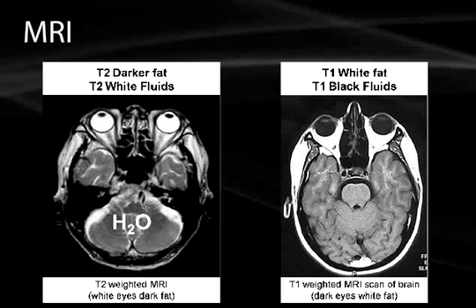One way to remember this is a little memory aid known as H2O. H2O, of course, is the symbol for water, so what this reminds you of is water in the 2 of a T2 film is O, which stands for opaque. So water is opaque in T2 films.